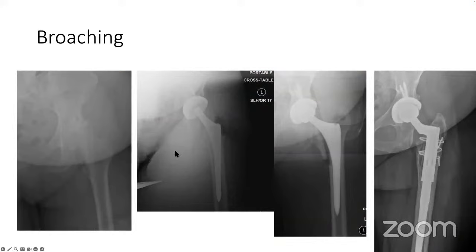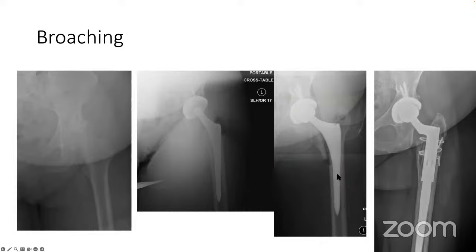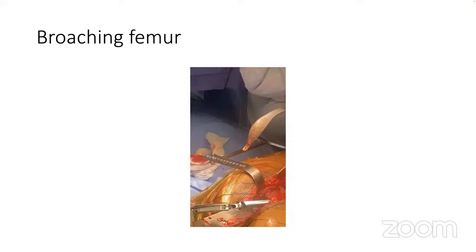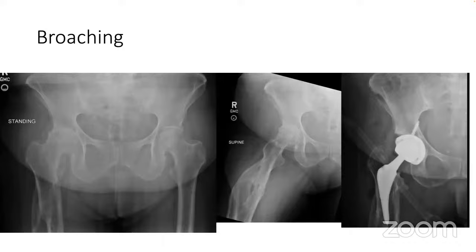This is an unfortunate example where this was not done. A severely arthritic hip with an intraop x-ray showing no fracture initially, but then after the stem is inserted — when most fractures happen — you see the result. The broach is slightly smaller than the final implant because of the porous coating, so when you hit the final implant, it's like you've tapped a pathway for a screw and just follow the pathway — you don't force it. Otherwise you end up with a big calcar fracture and have to use a diaphyseal fitting stem, or repair it and cement a stem.